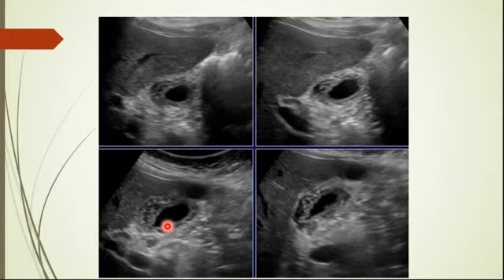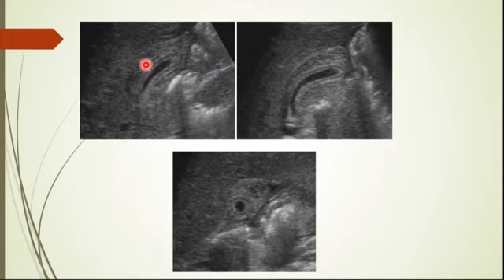Indicates what? Hepatitis. Exactly. Thank you. This is a very common finding in hepatitis. Okay. Another example. This was infectious mononucleosis. You can see the gallbladder wall is thick and edematous, and it looks like cholecystitis, but there are no stones, no signs of inflammation at all. Also, the clinical presentation is not in favor of cholecystitis.